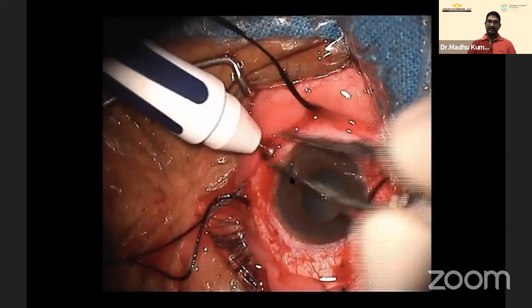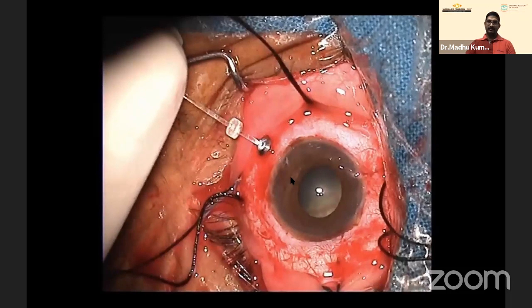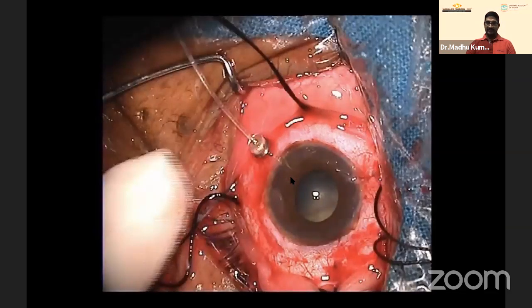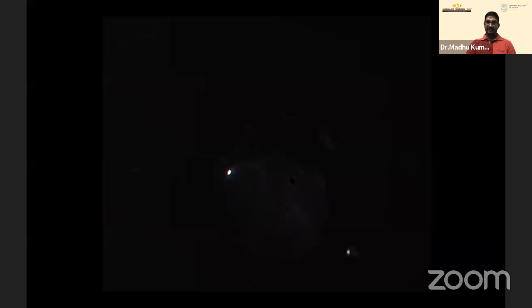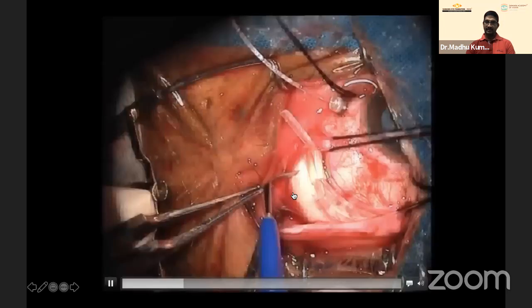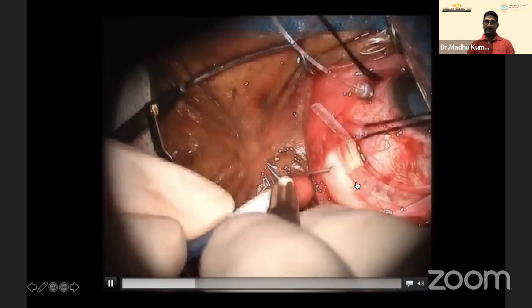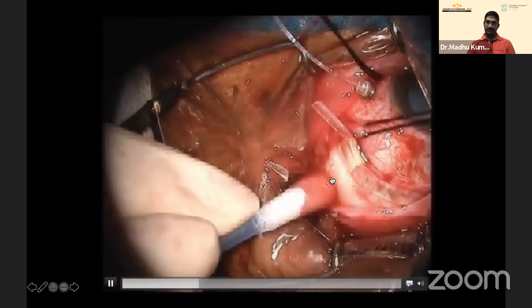The challenge in this case: removing the heavily encapsulated foreign body would require an extensive relaxing retinotomy. Since this is an inert foreign body sitting inside the eye for three years, the decision was to do a simple buckle surgery to settle the retina and leave the foreign body in situ. Chandelier-assisted buckle surgery was performed. Subretinal fluid was drained and a 240 belt was placed.